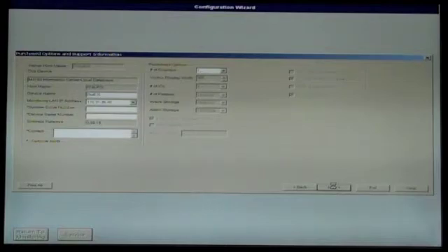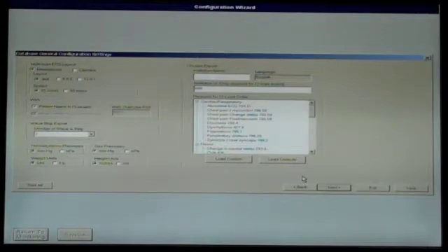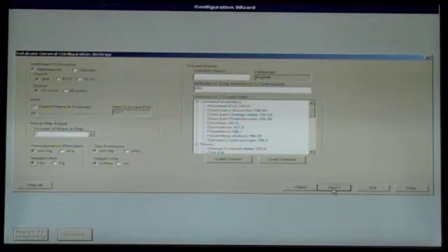The next screen is the Database General Configuration Settings screen, which is for a network system, which we will not be covering in this guide. Skip it by clicking Next.